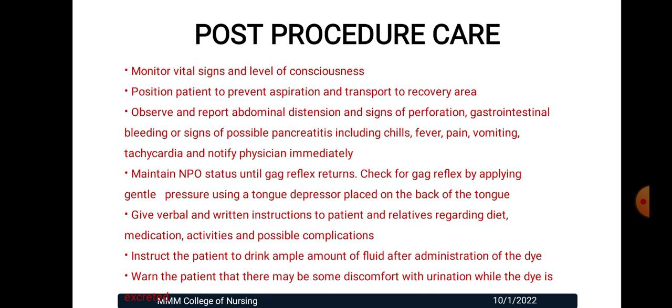Coming to the post-procedure care. After the procedure, monitor vital signs and level of consciousness. Position the patient to prevent aspiration and transport to the recovery area. Observe and report abdominal distension, signs of perforation, gastrointestinal bleeding or signs of possible pancreatitis including chills, fever, pain, vomiting, tachycardia, and notify the physician immediately.